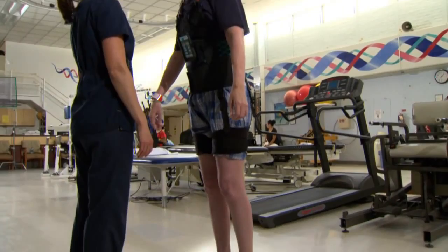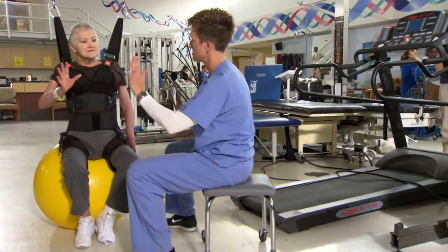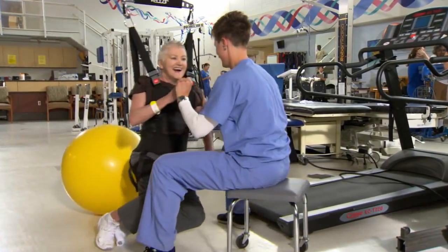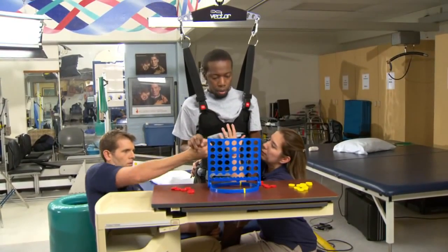I think one of the first things is obviously to let the patient feel the support of the harness and how it's going to catch them if they do fall, and letting them feel that to gain confidence in the system. Sometimes we do practice if they're really wary. We do let them simulate a fall. If not, we just go right into the session and let them start working on those things.